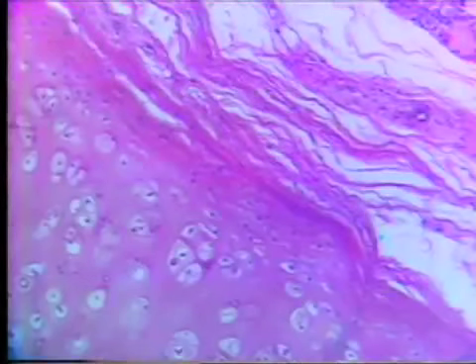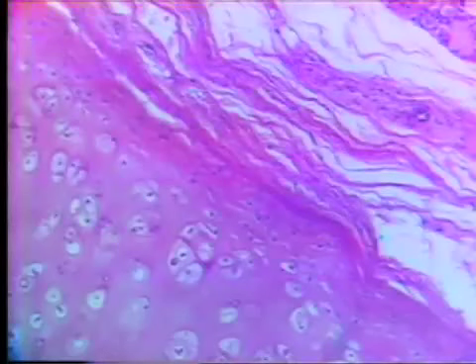Now I want to show you the other kinds of cartilage. Next we'll go to elastic cartilage. In elastic cartilage, elastic fibers are very clear. They shine and appear quite brilliant red, and they whirl and swirl around the cartilage cells. This type of cartilage is found in the cartilages of the external ear, also some in the eustachian tube, and I want to show you some elastic cartilage that's found in the epiglottis.